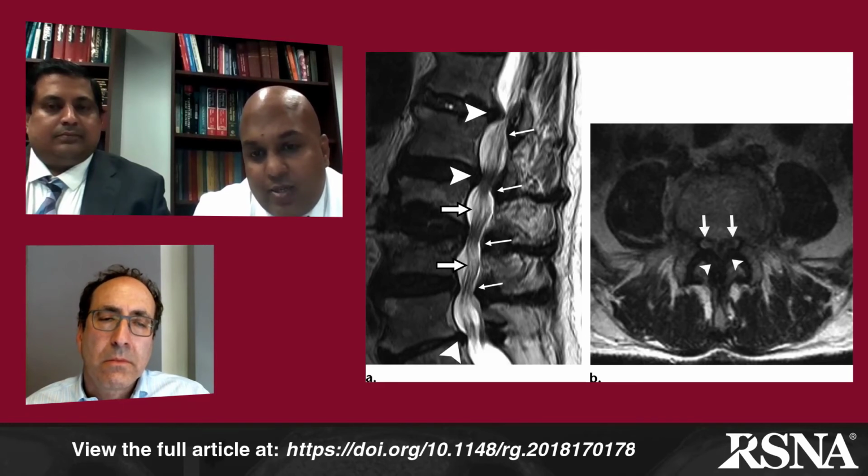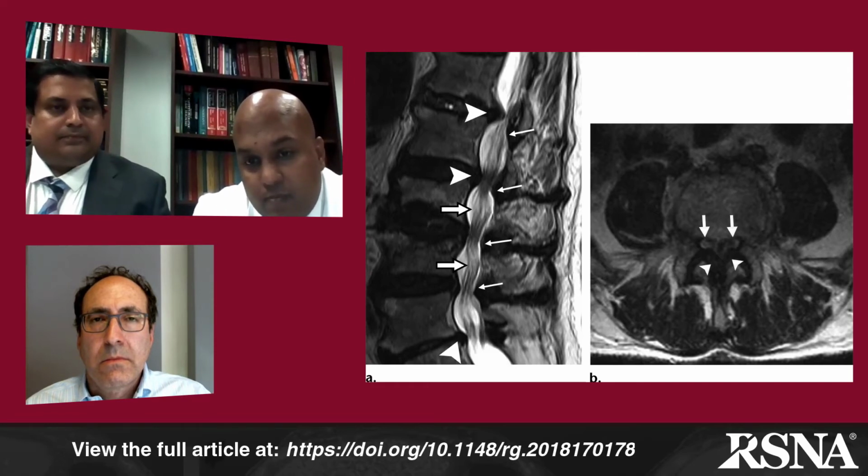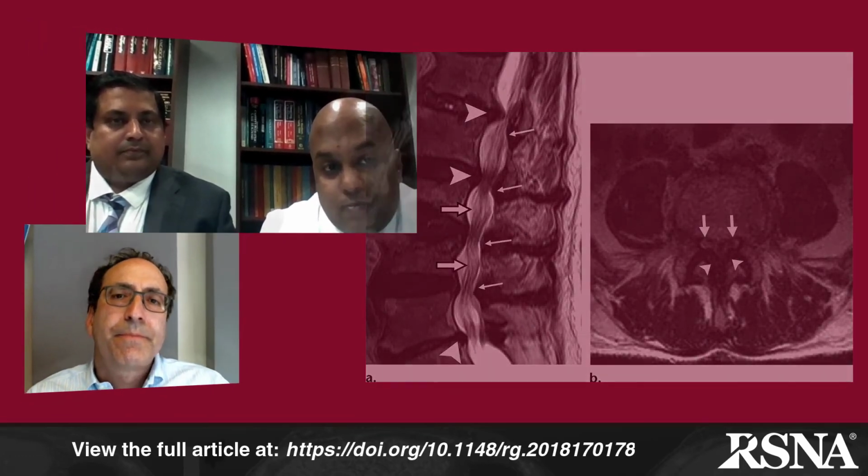The axial T2-weighted image below demonstrates a trefoil or tri-leaf appearance of the spinal canal and thecal sac related to degenerative disc disease with buckling of the ligamentum flavum posteriorly. And that's an appearance you can classically see with moderate or severe spinal canal stenosis, especially within the lumbar spine.